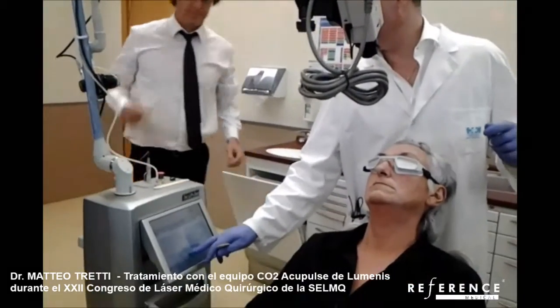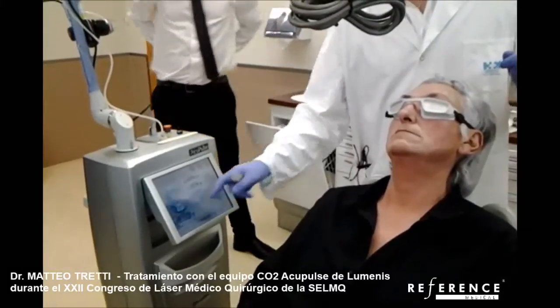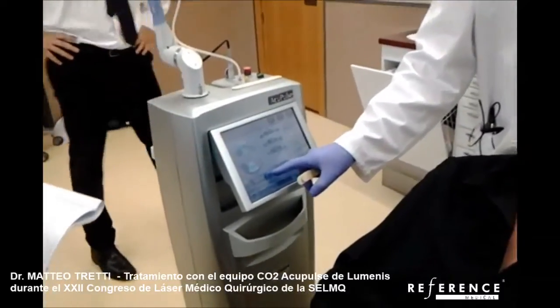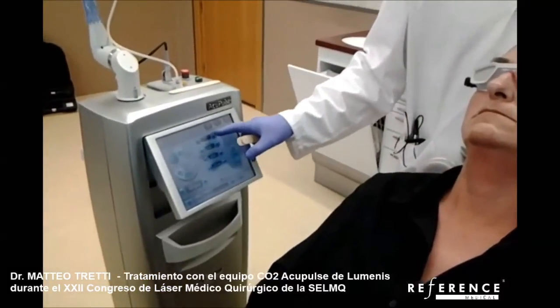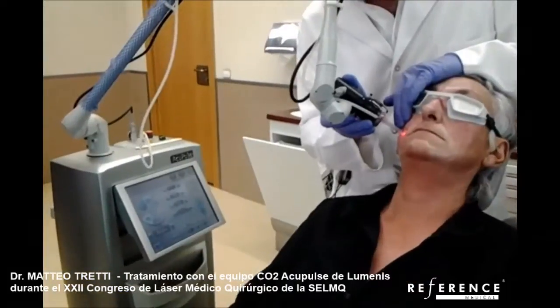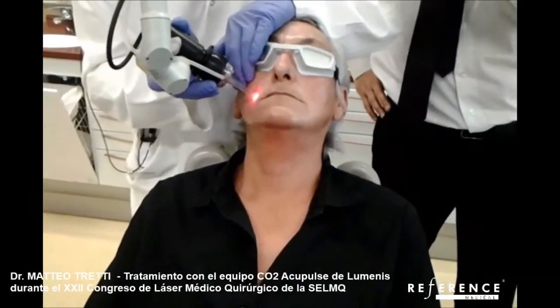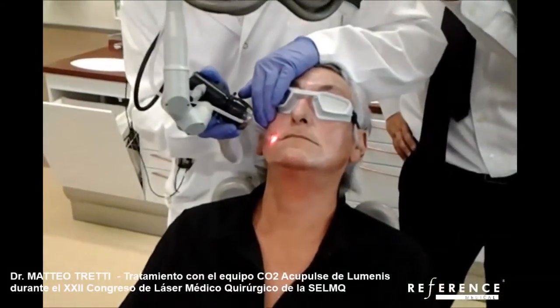I put the device on the deep mode. In deep mode I can deliver a shot of 0.12 mm in diameter, so 120 microns. I will use aggressive settings: 20 mJ for each shot, line shape, and 5% density. I locate the wrinkle and do the first shot, second, following the base of each wrinkle.